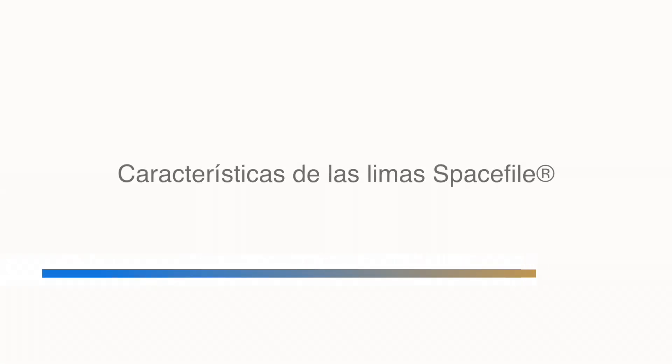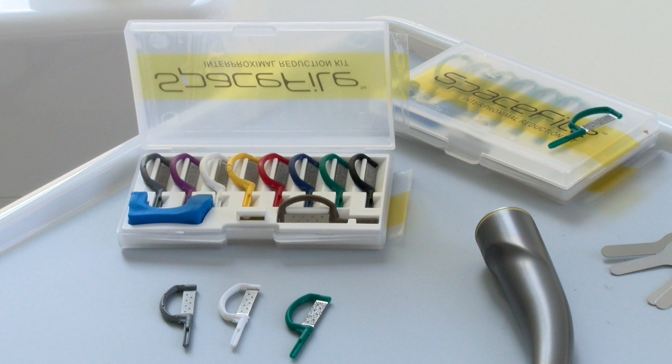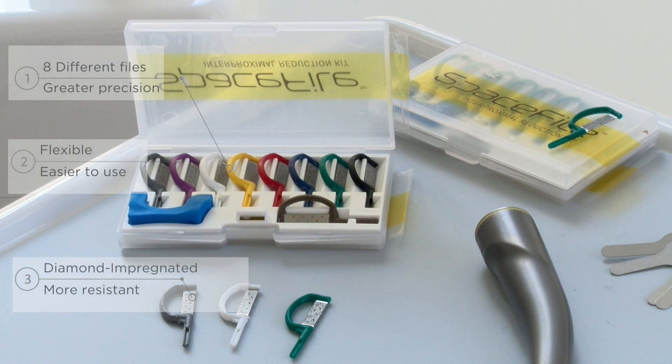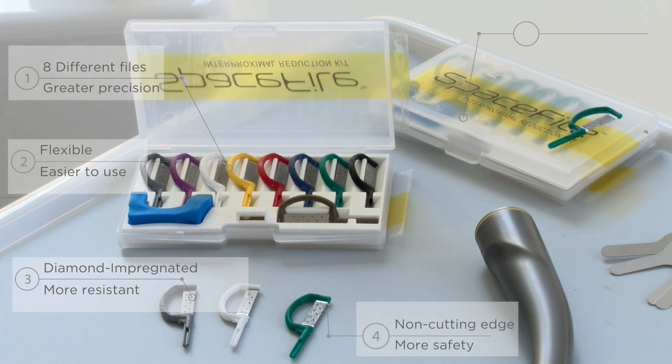Features of SpaceFile files. Eight different thicknesses, which provide us with greater precision. They are flexible, but at the same time, as they are diamond-impregnated, they are also very sturdy. The lower edge is dull, which prevents us from cutting the gum. And they are also reusable, because they are autoclavable.